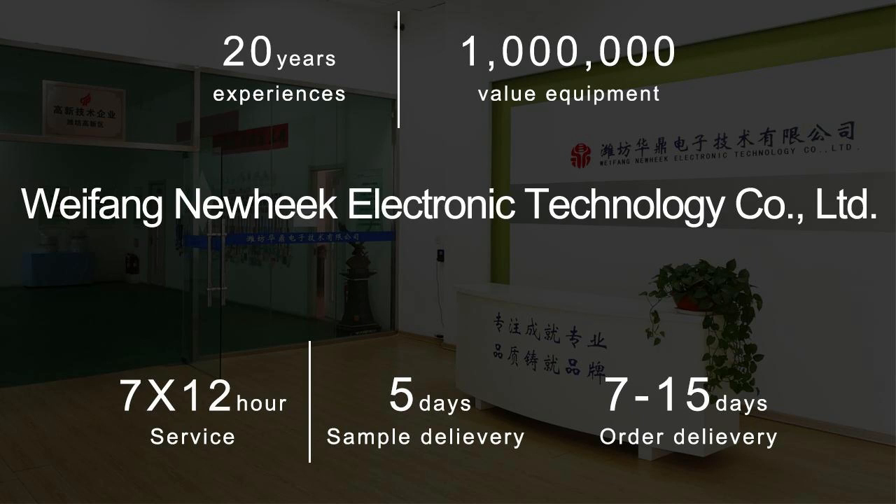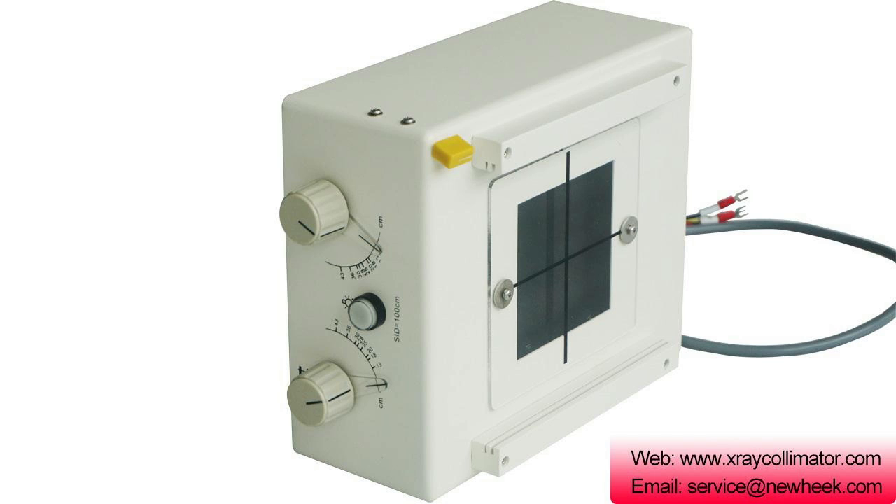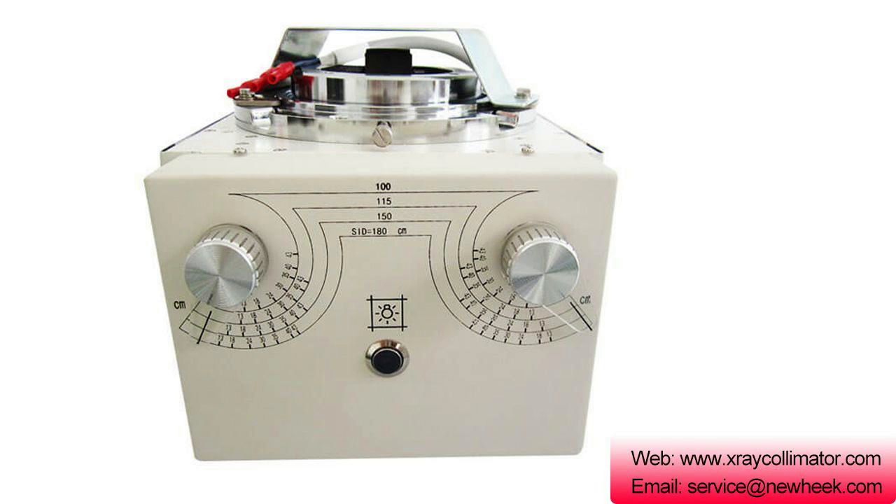Nuheek X-ray collimators are mainly manual and electric. The manual X-ray collimators include NK-102, NK-103, and NK-202. These three models of X-ray collimators are used for filming.